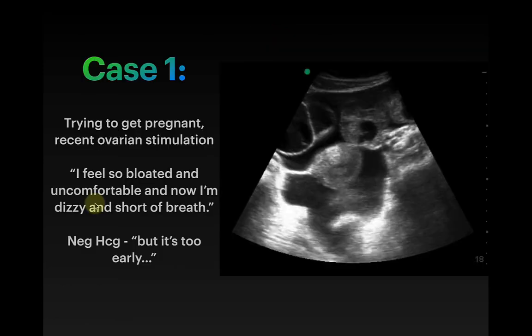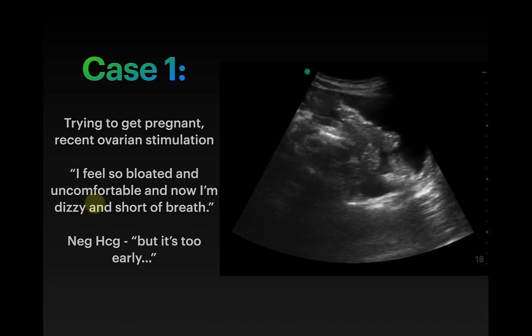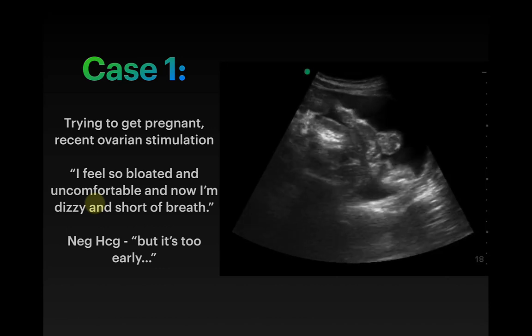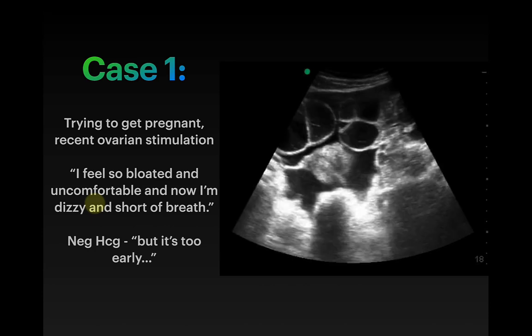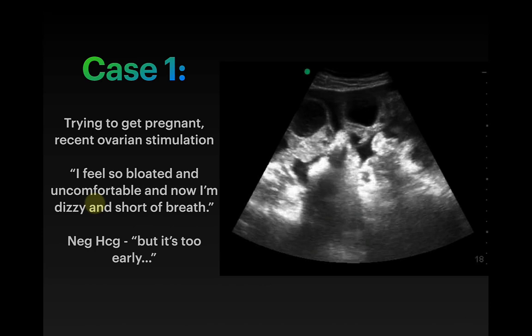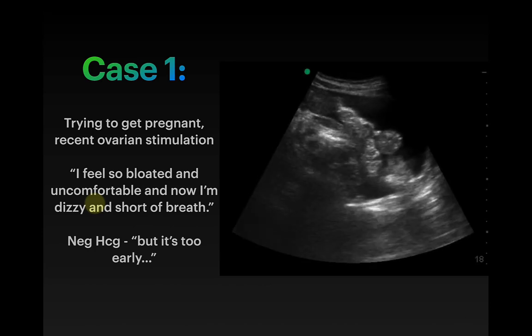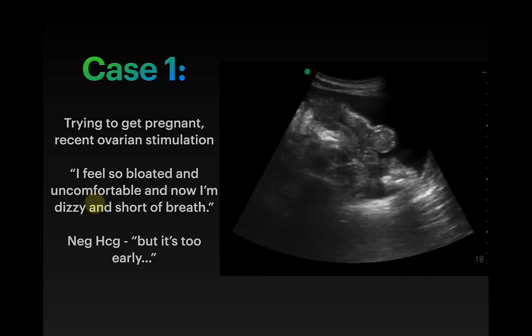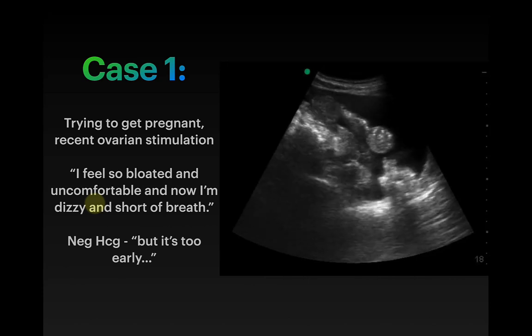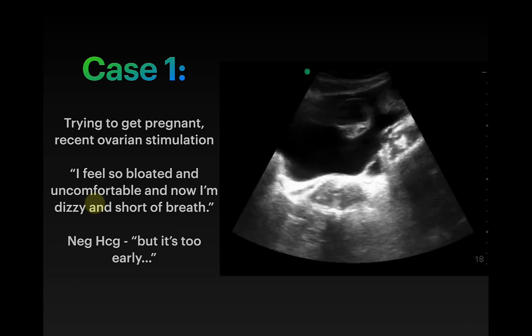All right, a couple of cases for outside the uterus in the pelvis. This is a patient who, as Dr. Kitab said, came to TAC, because that's always where you go when you're having troubles with gynecologic and OB problems. She's doing IVF, and her OB is out of town this week. Even though OBs are really, really cautious with these people and take very, very good care of them, her OB was out of town, and she was having trouble getting hold of the person who was supposed to be covering. She says, first I was really bloated. I've gained 10 pounds in the last week. Now I'm short of breath, and I'm dizzy, and my stomach hurts so much.